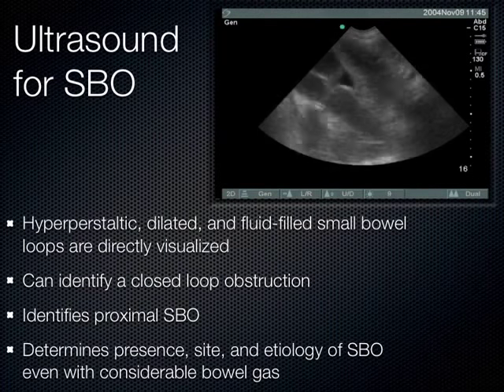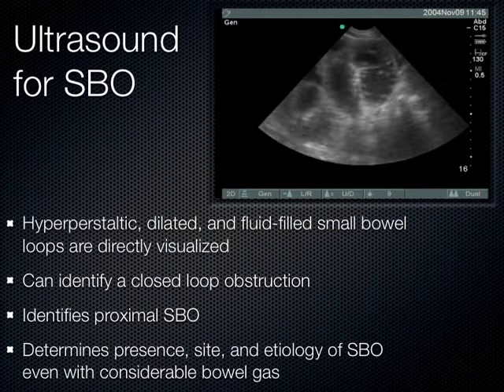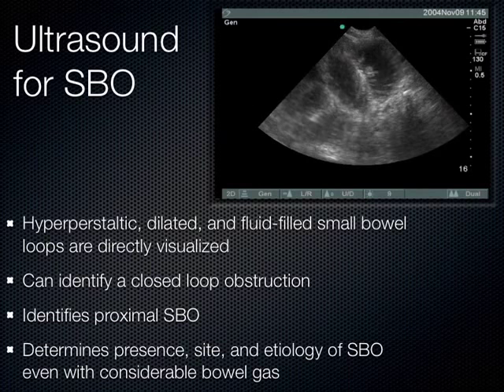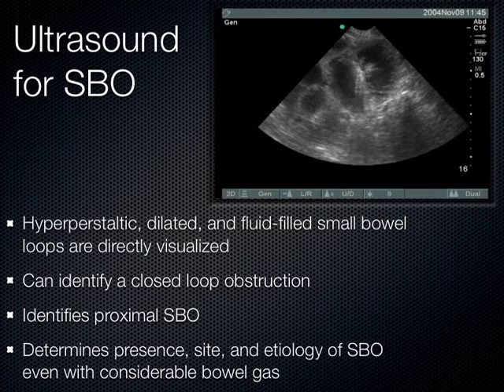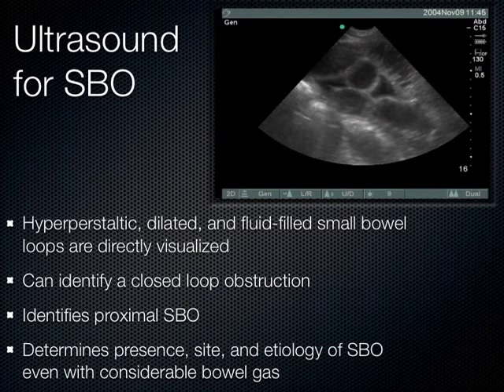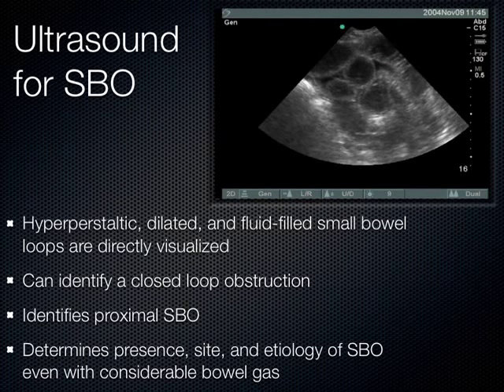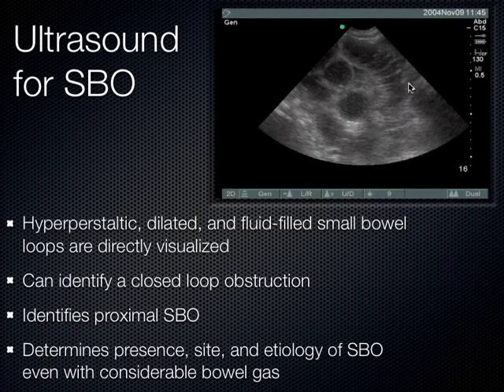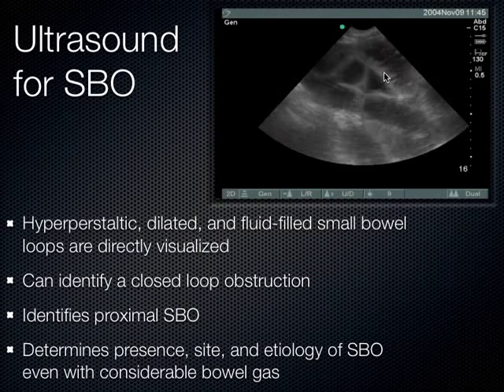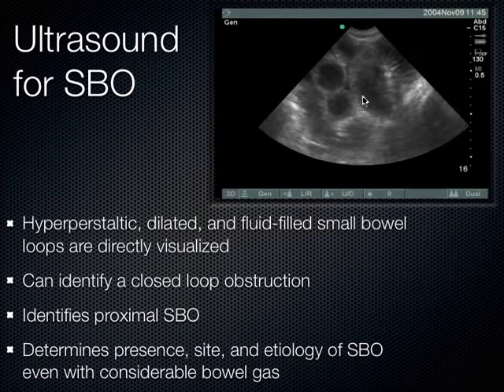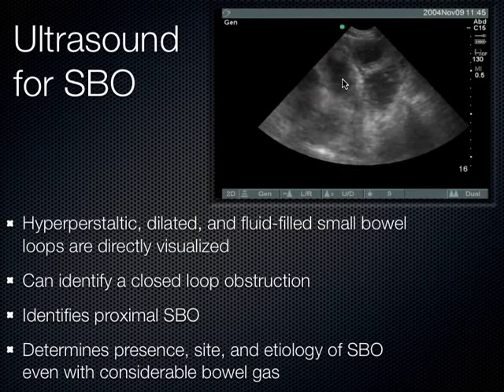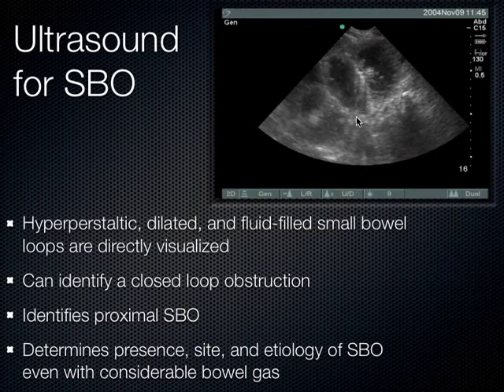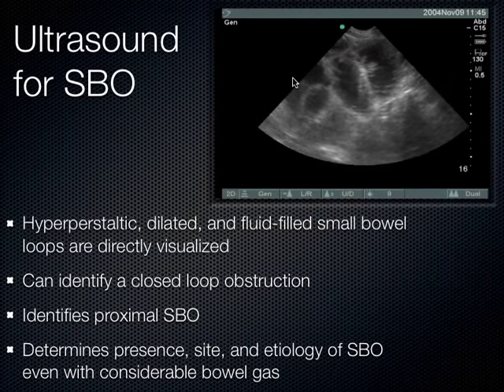What we see initially are hyperperistaltic, dilated, and fluid-filled small bowel loops directly visualized with ultrasound, evidenced by their plicae circulares — telling us this is indeed small bowel. This patient had such a bad small bowel obstruction there was perforation, and fluid leaked out between the loops of bowel. Fluid is always black on ultrasound, and we can see these anechoic wedges of free fluid between the different loops of bowel.